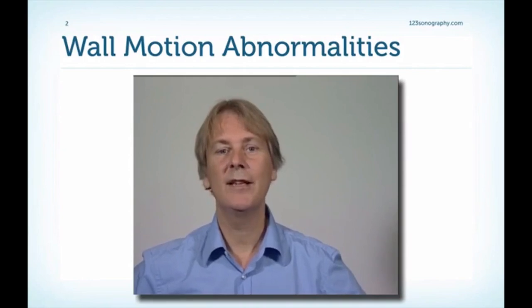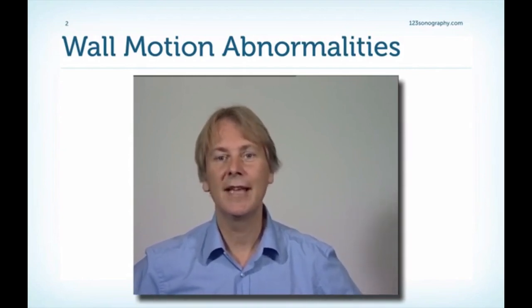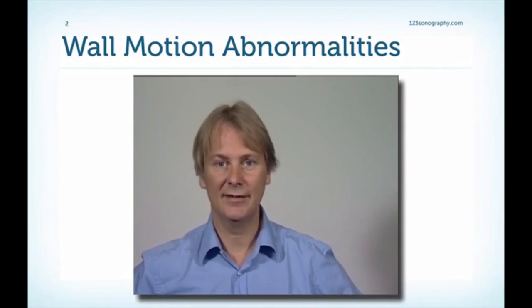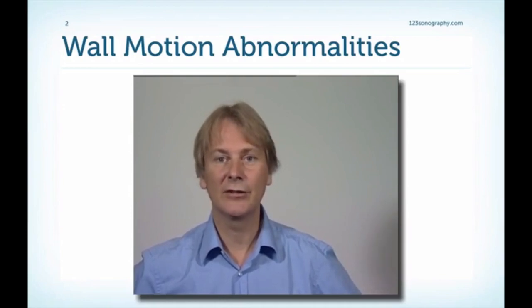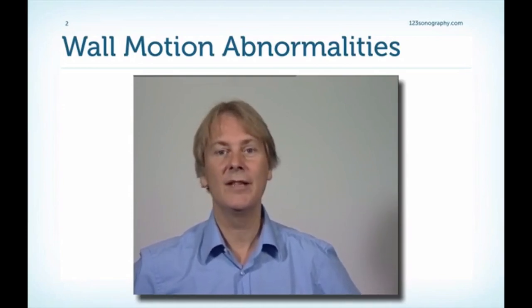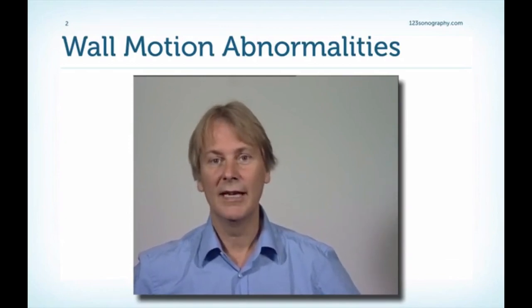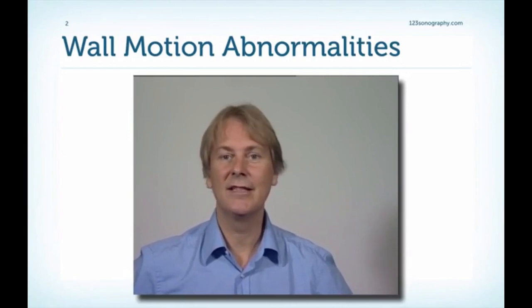I still remember way at the beginning of my times in echocardiography, when I was still learning, I was always attending my professor when he was reviewing studies. And he would be doing that from a video recording. You know, at that time we did not have digital echocardiography. And he would be sitting there and doing these studies in fast forward mode. And he would make diagnoses like hypokinesia or whatever, akinesia in even small segments.